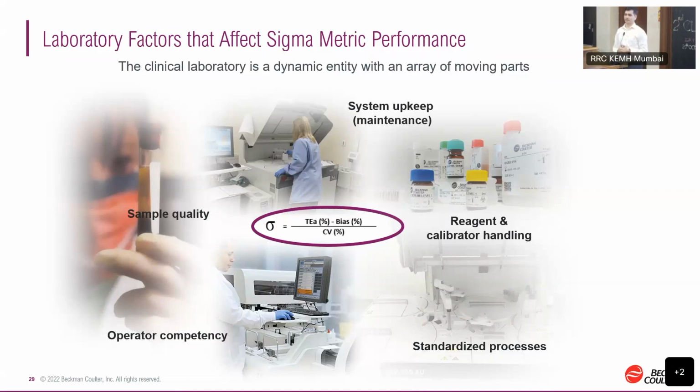In the market, there are many analyzers available, so the maintenance time can vary, maintenance steps can vary, and the manual intervention can vary. All these components should be taken into consideration because performing maintenance is manual. So the person who is running that instrument may not be consistent with these maintenance processes.